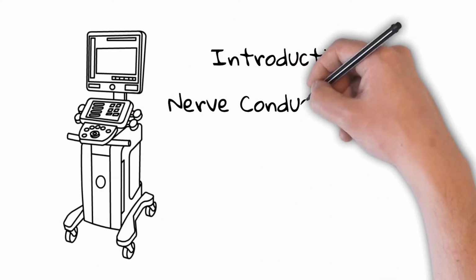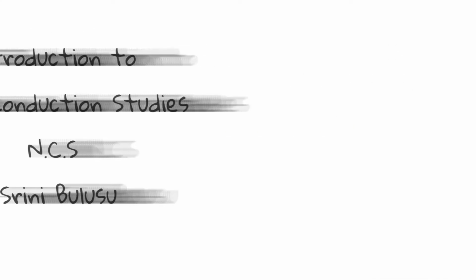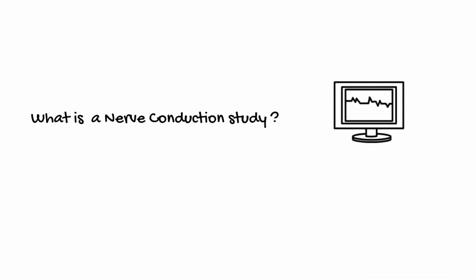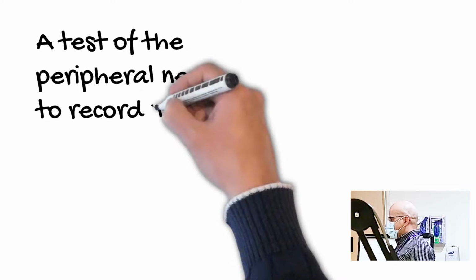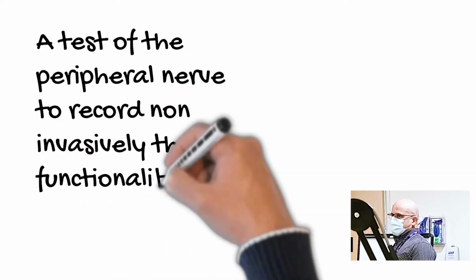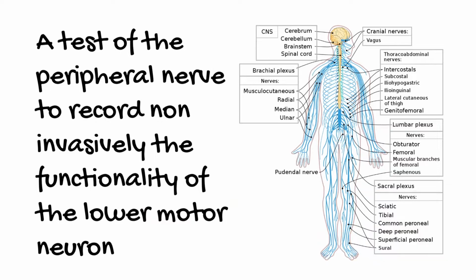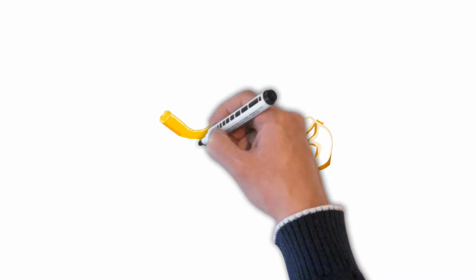Today, the workshop is all about NCS, nerve conduction studies. So, what is a nerve conduction study? A test of the peripheral nerve to record non-invasively the functionality of the lower motor neuron, which means after it has left the spinal cord.